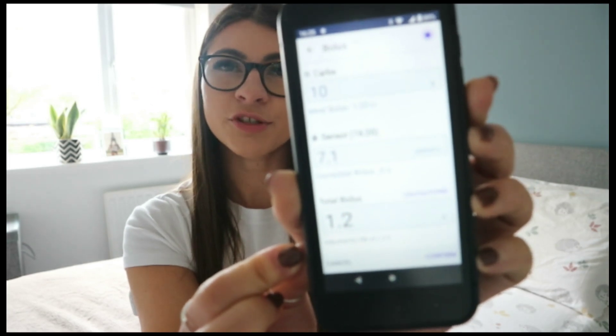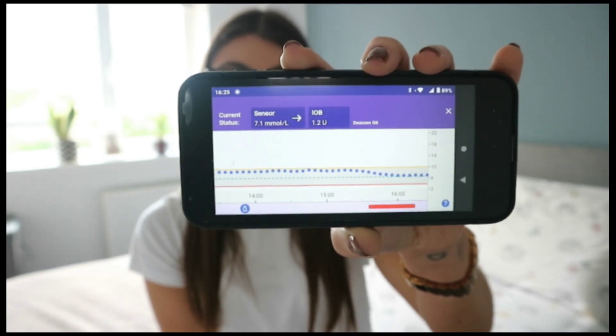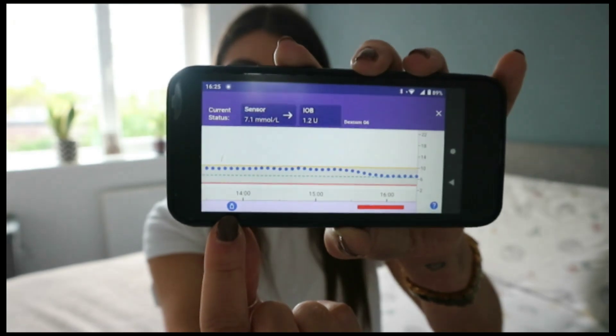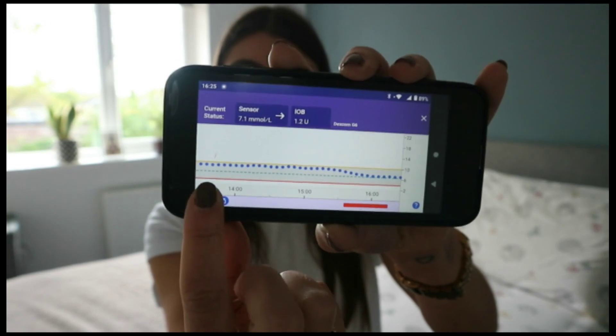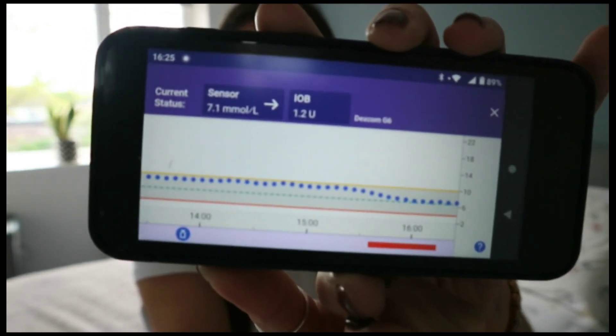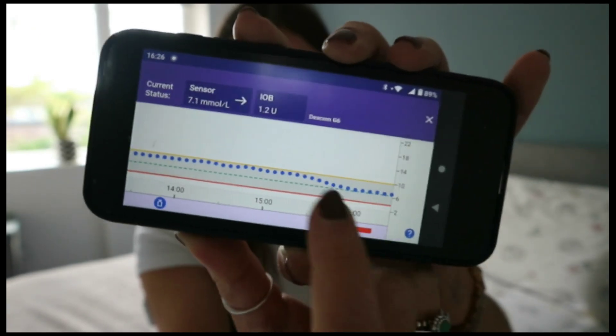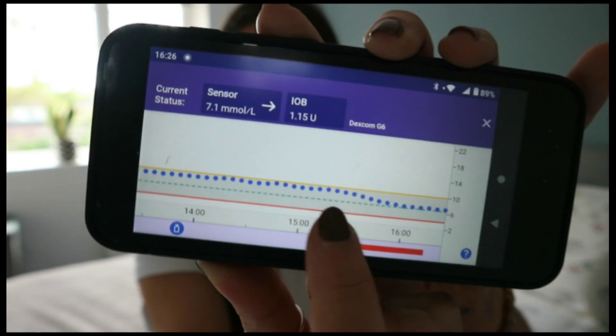I would just confirm that I want that dose to be delivered. There are loads of different features — it's really cool. Another feature I quite like is a little sensor graph showing the last three hours of what's been happening: I can see when I had my lunch and gave insulin, what my blood glucose has been, the green line which is my target glucose, and where the pump has paused my insulin because it noticed I was going below my target. It's quite cool to be able to see what the pump is doing.